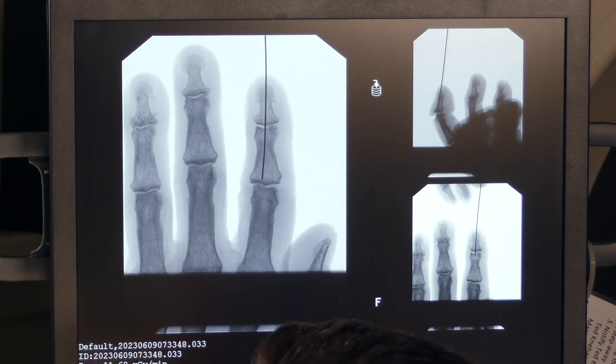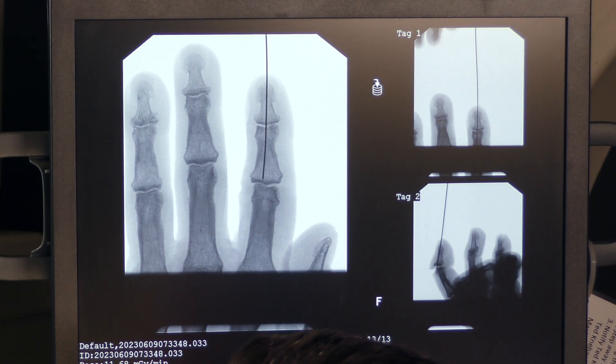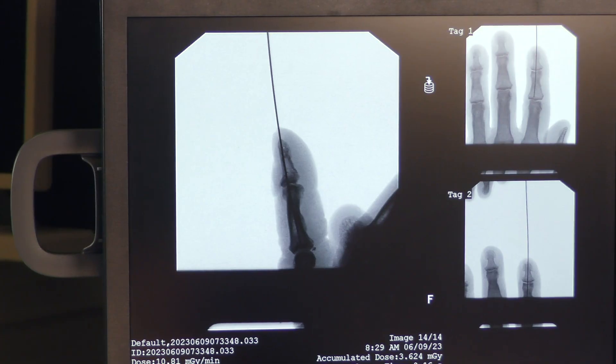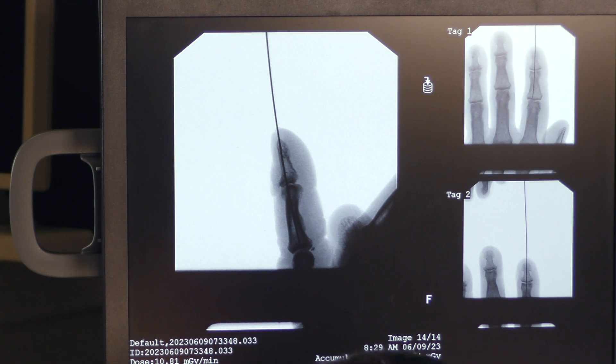Now we can again confirm under fluoroscopy that we like our pin position — right down the middle on the lateral as well.